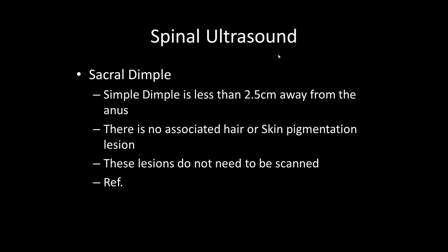Spinal ultrasound, I was mainly going to focus on the fact that there are many infants that are born with a sacral dimple, and frequently we are asked to scan infants for this sacral dimple. Reading the literature, it became quite clear that a lot of the sacral dimples do not need to be scanned and are not associated with spinal abnormalities. With the increasing advent of antenatal scans, the use of folic acid antenatally, the value of skin pigmentation and this simple sacral dimple as an indicator of an underlying occult spinal problem is becoming less.